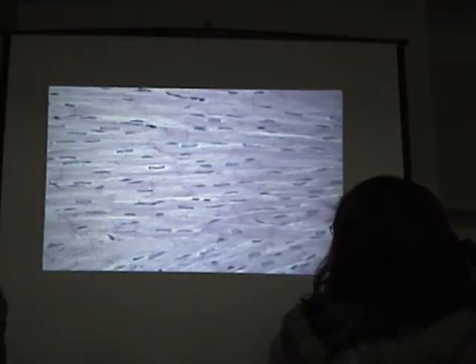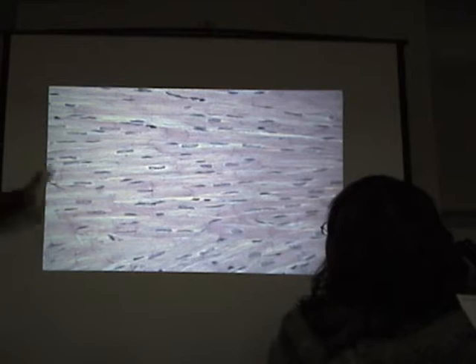Okay, what kind of muscle? All right, and this micrograph is replete with intercalated discs. They do exist, in spite of what some of you may feel having looked at your slides. We have 3 or 4 slides of cardiac muscle, and generally there's one of those that really shows you the intercalated discs, okay?